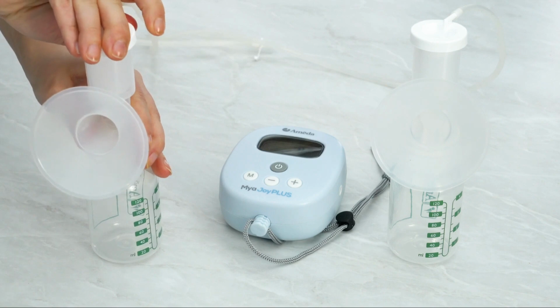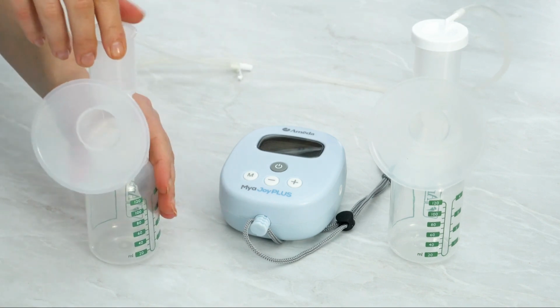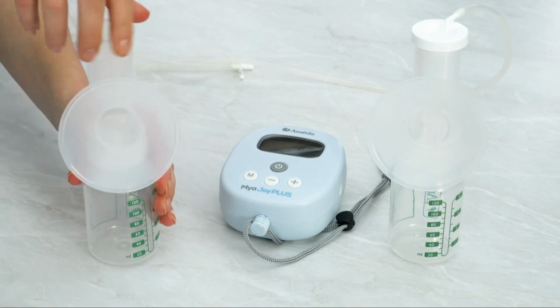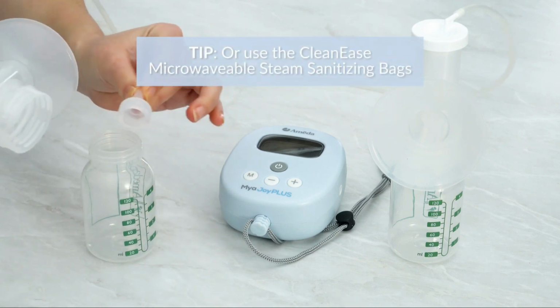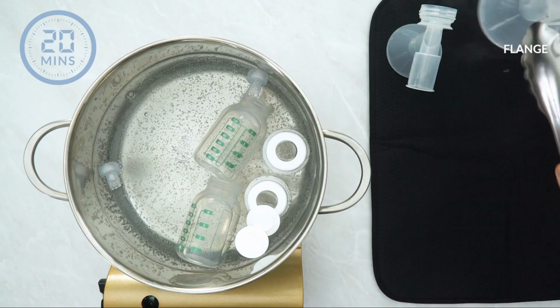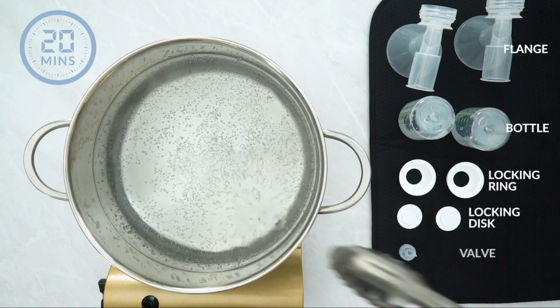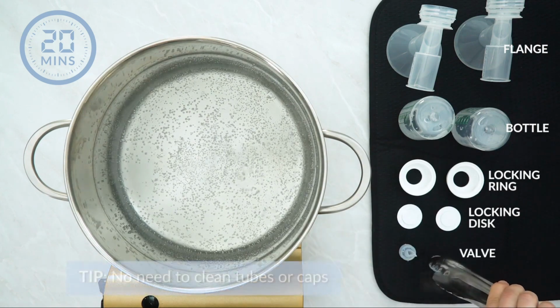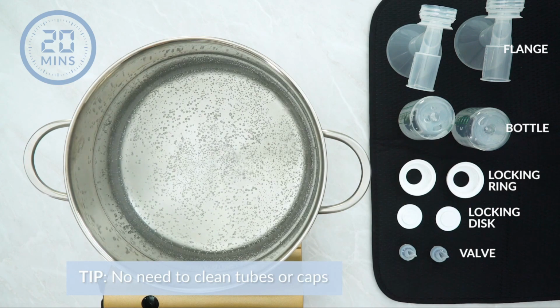Before first use, sanitize all the parts of the HygieniKit except the adapter cap, tubing adapter, and pump motor. The recommended method for cleaning is boiling for 20 minutes. Boil the flange, milk storage bottle, locking ring, disc, and valves for 20 minutes. Allow parts to fully dry. Do not clean the tubing and adapter cap.